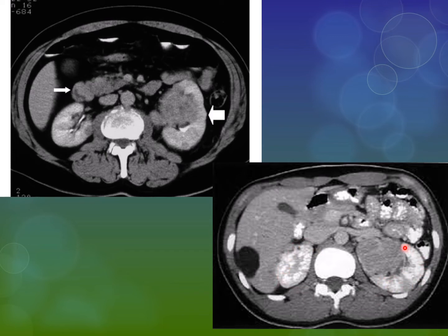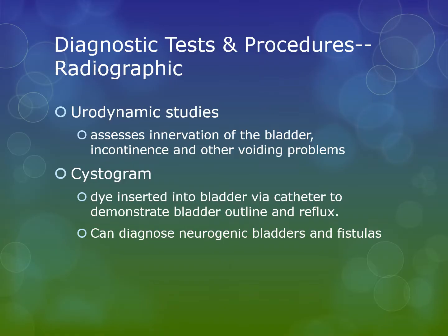This kidney, not so much. And oh, look at that. And there's no question that that is solid. I mean, nobody's going to look at that and think that's a cyst. That is solid tumor material, and the likelihood that that is cancer is actually pretty high.